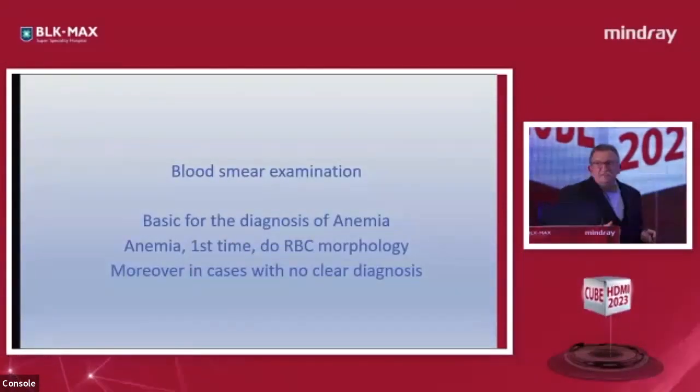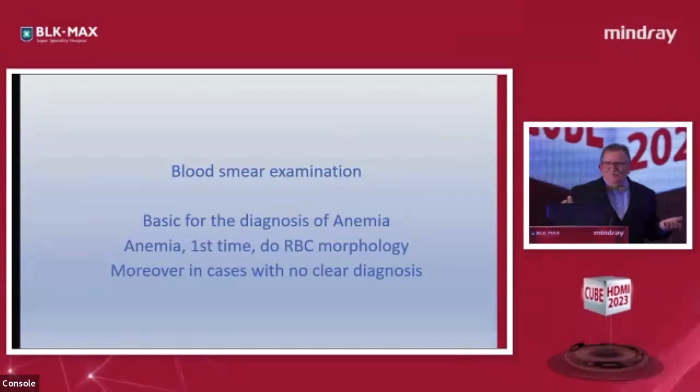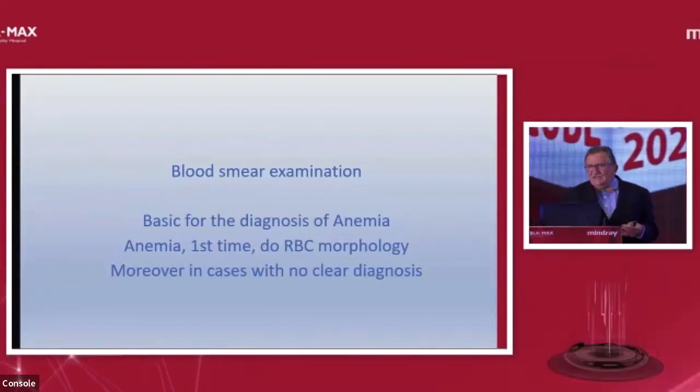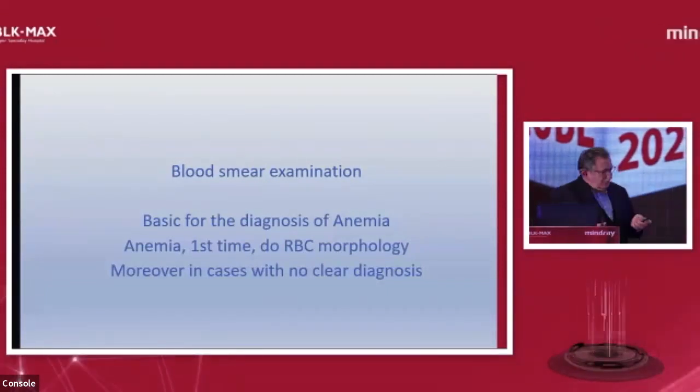Of course, first is the blood smear examination. We try to get the best from the instrument, because we don't want to miss any abnormal case. But for me, the microscope is mandatory. I have 3 microscopes in my home. For this reason, I love microscopy.